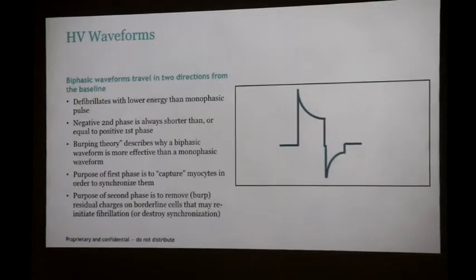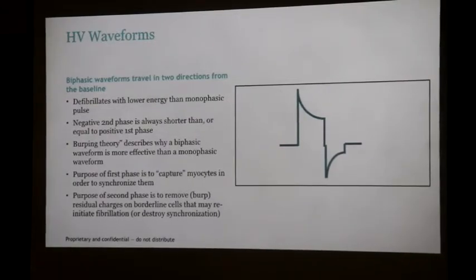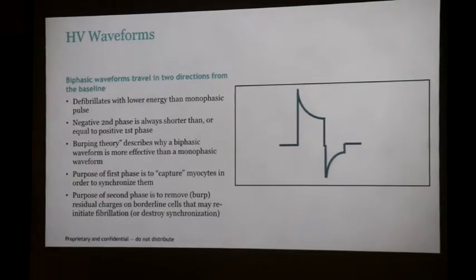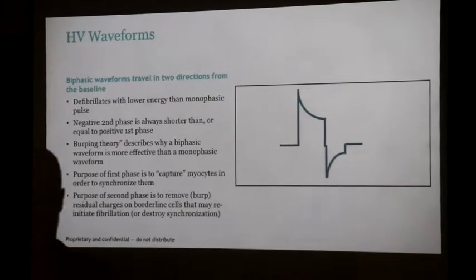Yeah. Most of these patients don't need pacing. So we haven't got a problem. They haven't got a problem pacing because they don't need pacing. Actually, most patients, only if you have AV block do you usually need post-op pacing. But if we're talking about the future, if you have a patient who only needs shocks, minimally invasive is nice.